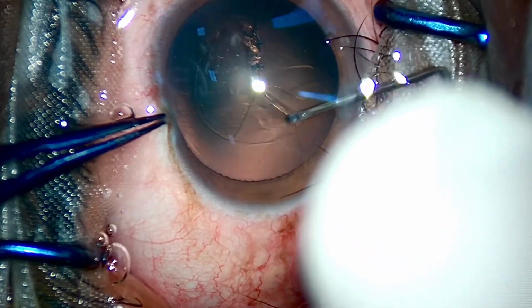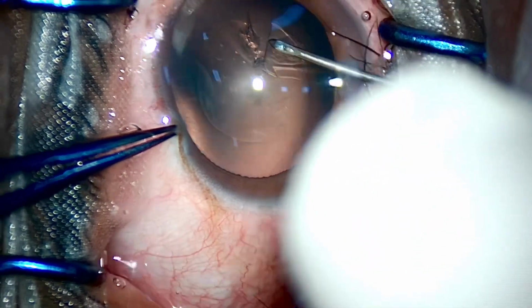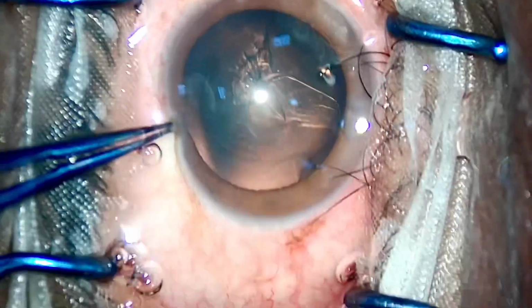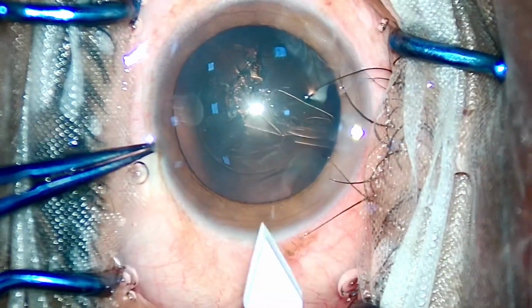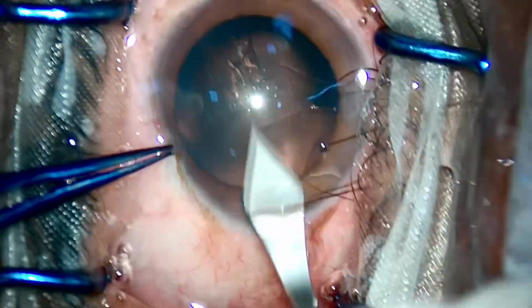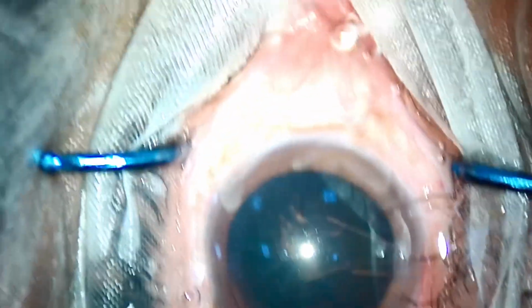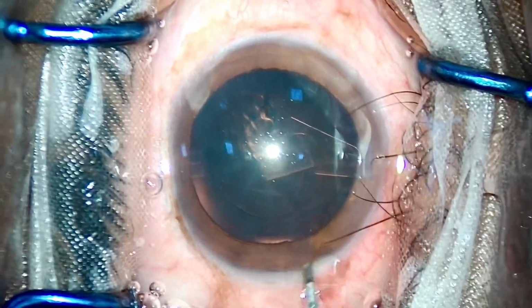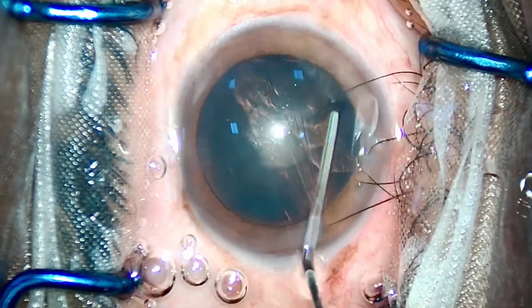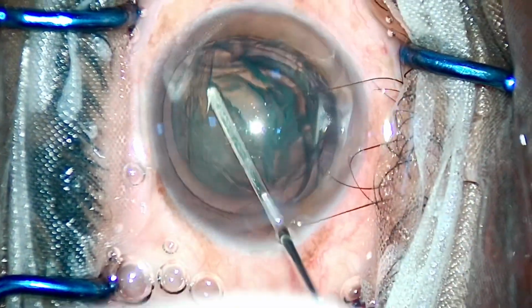Some surgeons produce an SIA of around 0.5 diopters, some surgeons have 0.75, and in rare circumstances where there is wound gaping or the use of coaxial irrigation aspiration cannula, the gaping of the main port is such that they can even induce 1 diopter of cylindrical power in the postoperative period, which can keep patients unhappy for a long time because their unaided vision will tend to be in the range of 6 by 12 or 6 by 9. These patients never achieve a vision of 6 by 6 because of astigmatically unneutral incisions.